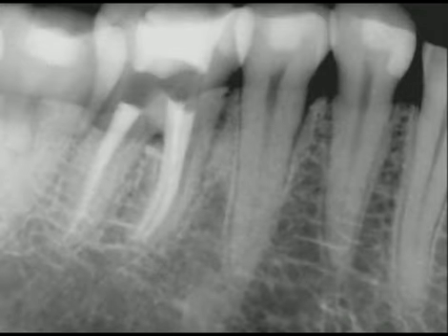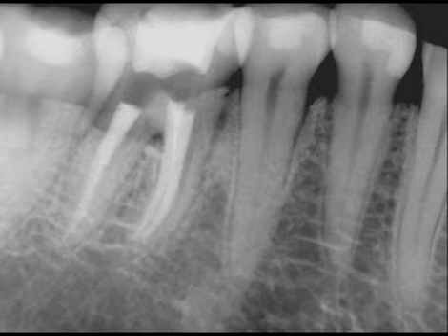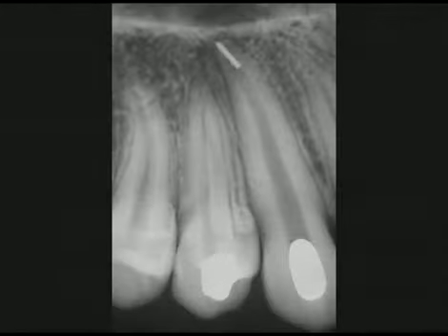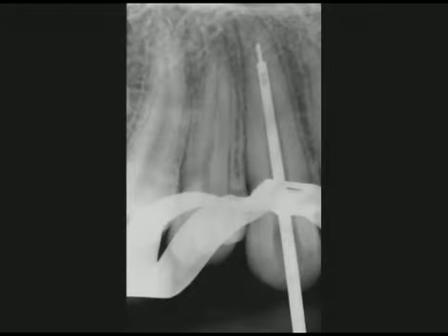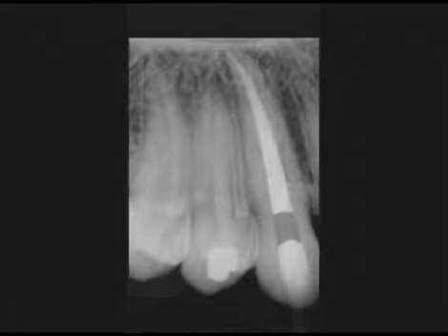Notice the furcal canal and the distal system bifurcating apically. Here's a preoperative radiograph of a temporized maxillary canine and an instrument broken deep in the apical 1/3. A working film shows that the IRS has successfully engaged and partially elevated the deeply positioned file segment. And the postoperative film reminds us of the necessary retreatment steps.